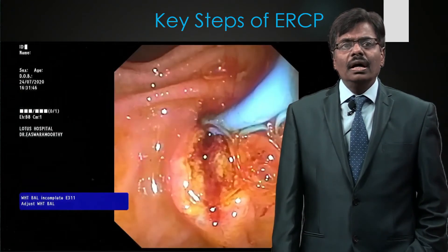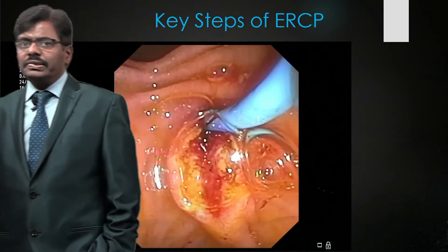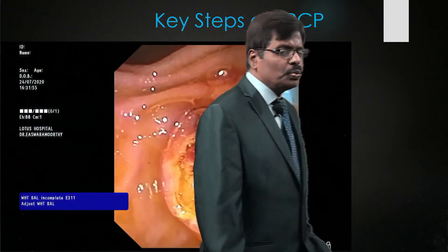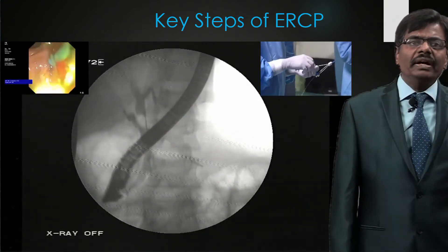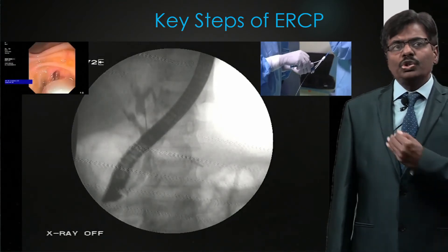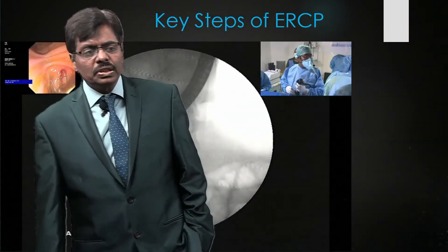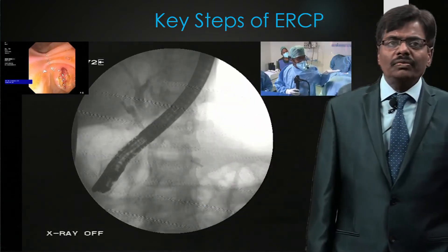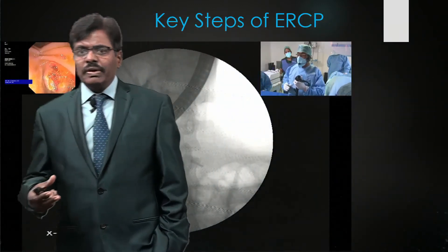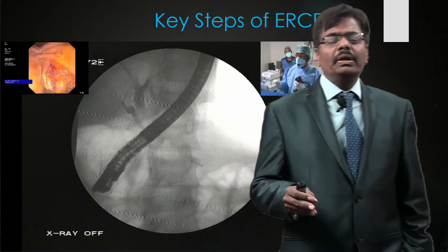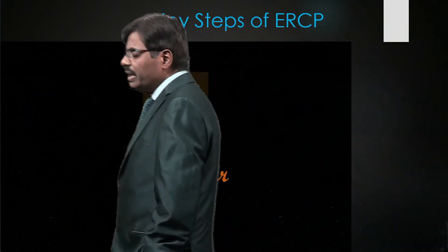This patient already had a laparoscopic cholecystectomy, so no stent was placed. This is the final balloon sweep — one more deflation, one more pass upward, then drag down to confirm no residual sludge. If the procedure goes well, it proceeds so smoothly. The patient is given indomethacin per rectum, and by the time she leaves the table, she will be ready for home the next day. When a case goes so well, the patient's recovery is truly gratifying.